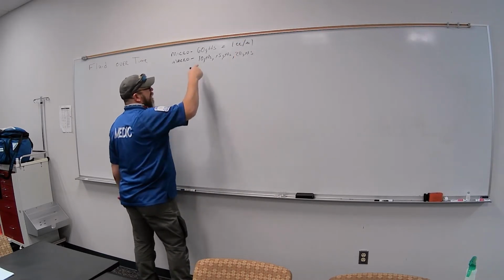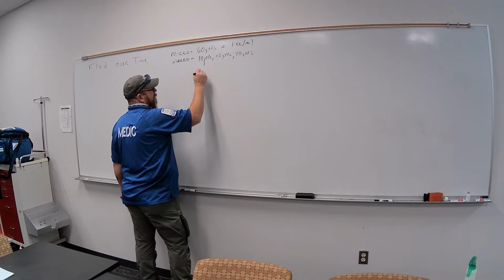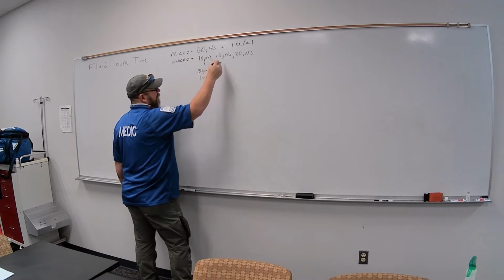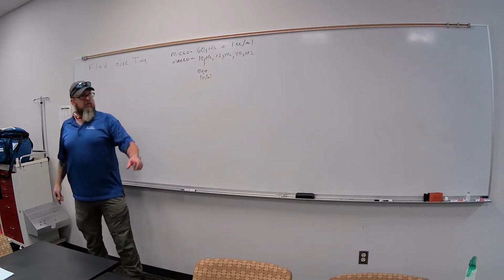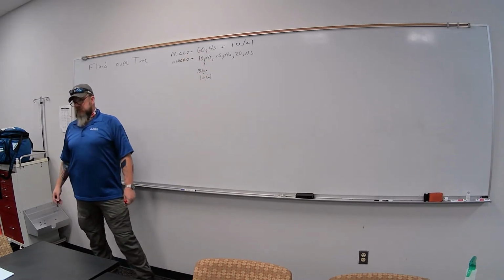With a 10 drop set, 10 drops is 1 cc or ml. Same thing with 15 and 20. So what's the difference between the drops on these? Over time, you just get more drops per.